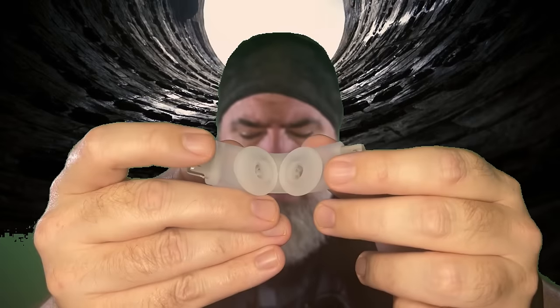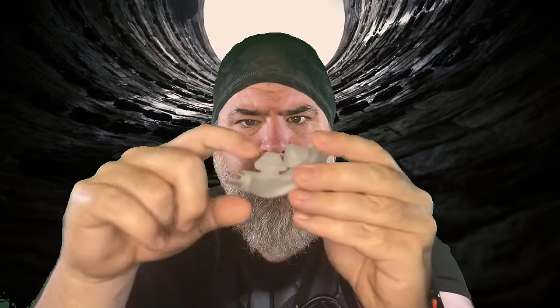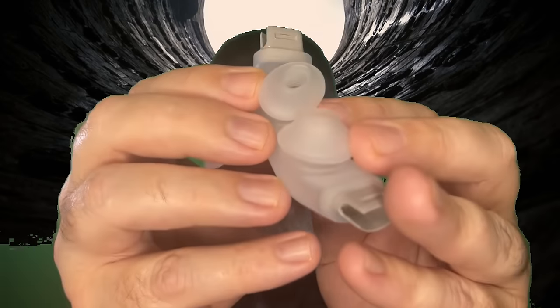I think a bigger problem is, I don't know if you can quite see that, but, yeah. There's actually a pillow within a pillow here. It's basically two nasal pillows, one wrapped around the other one. And the inside one is really, really stiff. So overall, do I have this on the right way? Yeah. So overall, I've got this hardness right here that I don't like. And I've got this stiffness in the nasal pillows that just wears my nostrils out, man. I wake up, again, with nosebleeds and chafing.